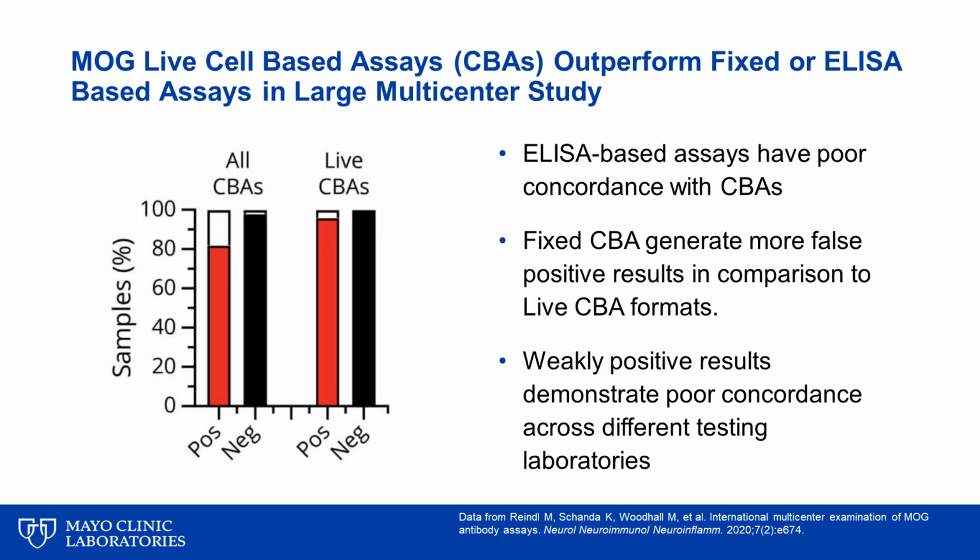It is therefore recommended that if results obtained on these assays are conflicting with the clinical picture, testing on a live cell assay should be pursued. Currently, our laboratory is the only reference laboratory within the United States utilizing live cell-based assays to detect MOG antibodies.